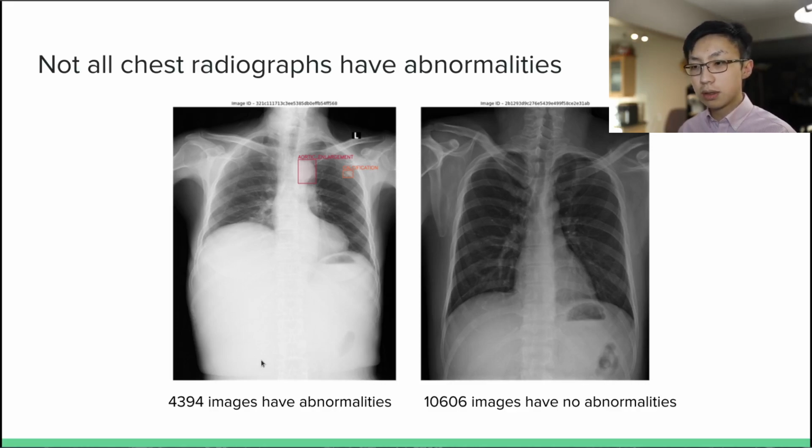This model also is trained on external datasets, namely ChestX-ray14 and PadChest, which were unified into a single dataset. The 2-class classifier scheme also has a secondary benefit aside from reducing false positives. Since the classifier narrows down the chest radiographs that must be inferenced by the slower object detection models, it's a little bit faster. For example, in the training dataset, there are 4,394 images with abnormalities out of a total of 15,000. This means we can filter out nearly 2/3 of chest radiographs.